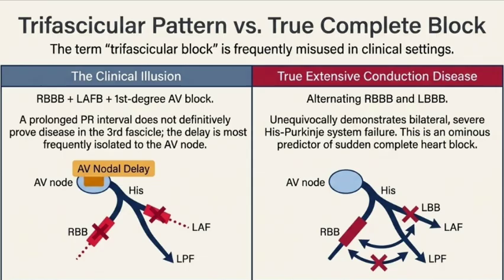Which brings us to the ultimate crucible of this deep dive, the ER reality check. We have all this incredible anatomical highway knowledge. We understand the vector mechanics pulling the compass needle. But how does a doctor actually apply this directly in a high-stakes emergency setting? That is the million-dollar question. Like when you see these patterns on the pink paper, how do you decide who gets discharged to go home and who gets rushed into the intensive care unit?